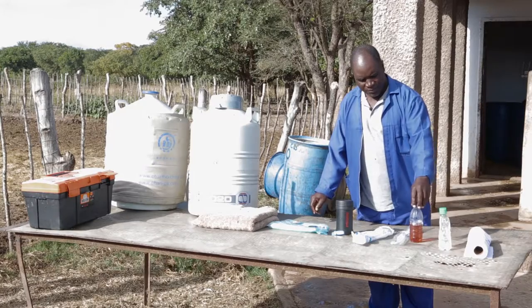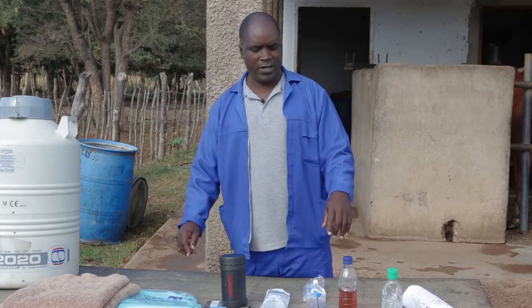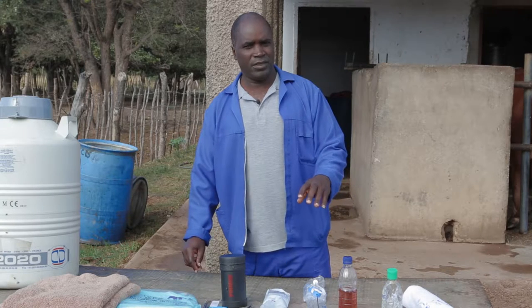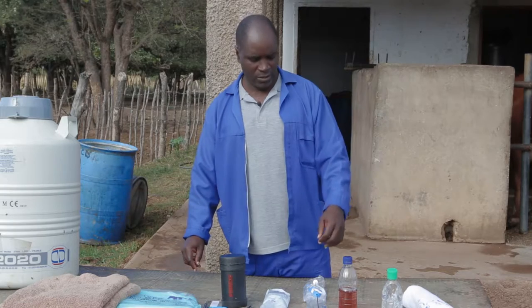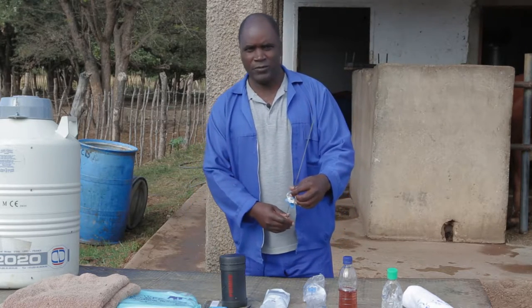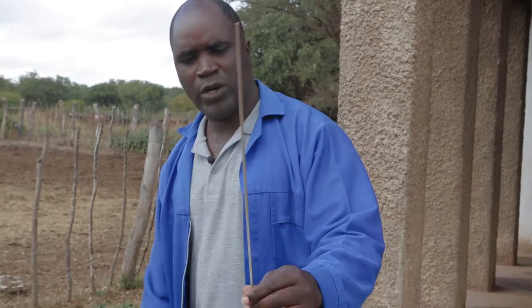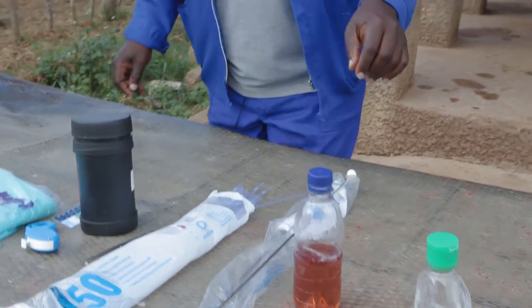We also have the disinfectant. We disinfect the vulva before we inseminate. And this is the artificial insemination gun. This is where we load the semen straw before we do the artificial insemination.